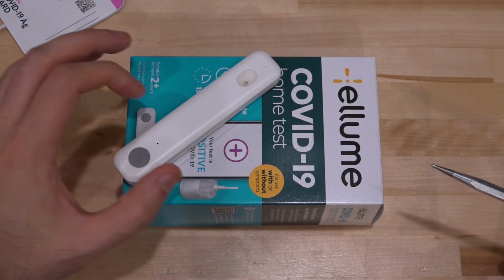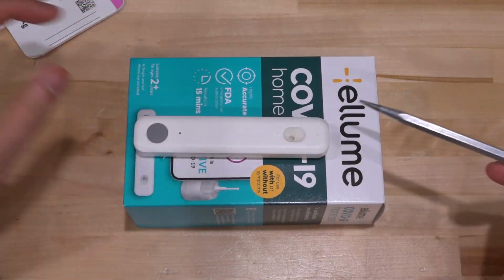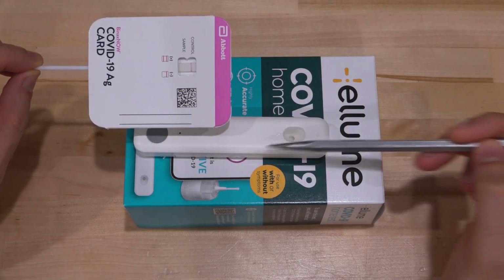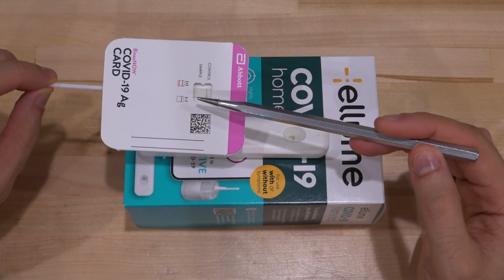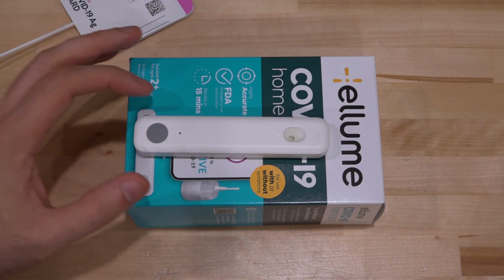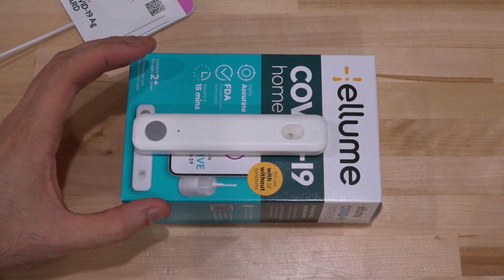Now, I'm more interested in figuring out how this instrument reads this, because I think the mechanism is exactly the same, and all this little thing is doing is reading whether there is one line or two lines, and then connects through Bluetooth to your phone. So it must be very simple in theory, but I wanted to open it up and take a look at it.